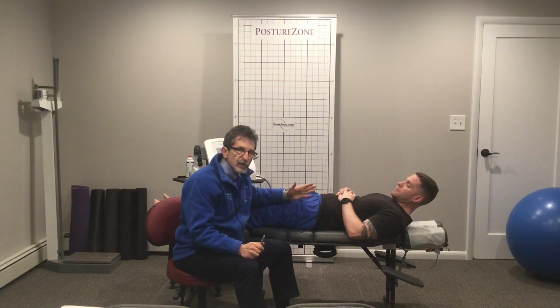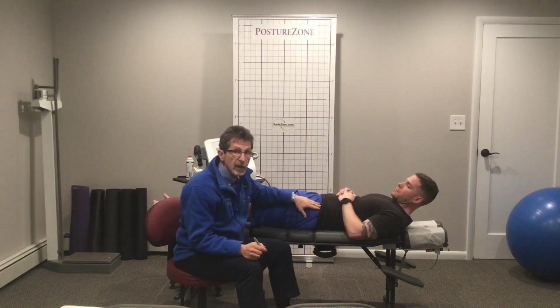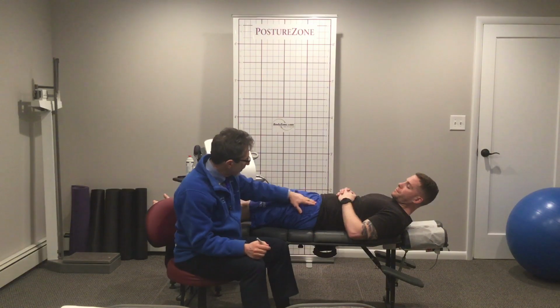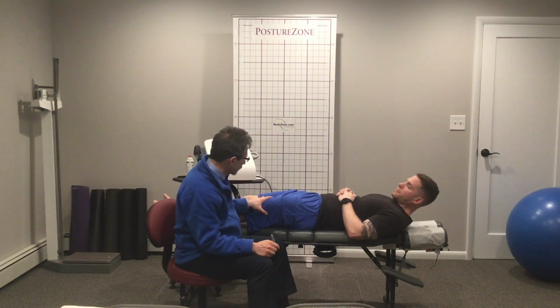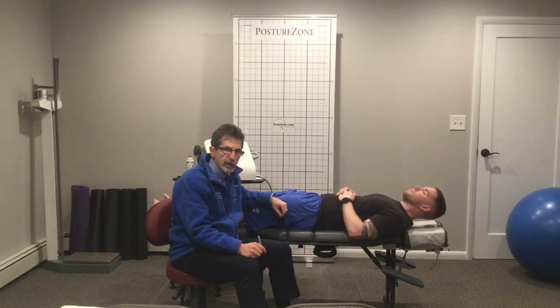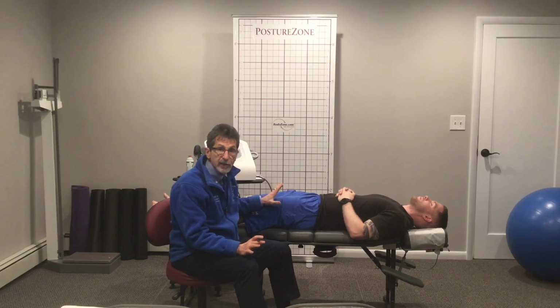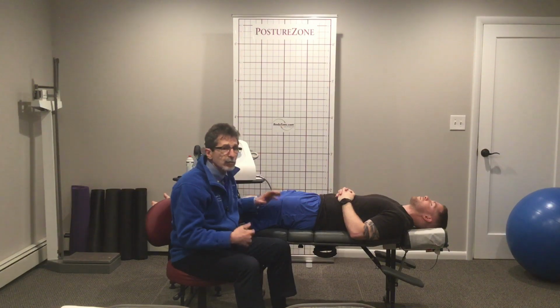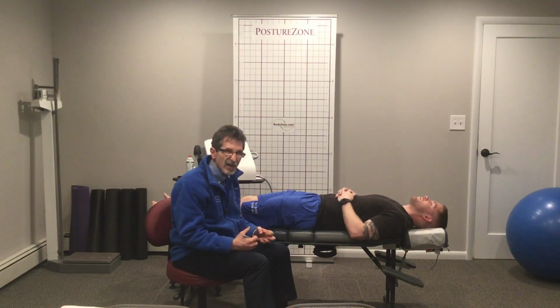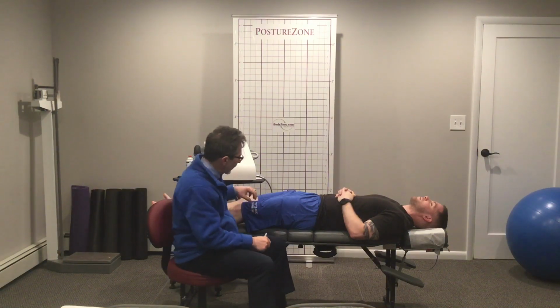So our job first is to differentially diagnose what muscle's involved. And sometimes even a sports hernia can mimic a hip flexor strain. In this case, we've analyzed it, we've determined that it's the rectus femoris that's the problem. So how are we going to treat it? Well, it depends on, is it an acute strain and we just want to ice and rest it, and sometimes that's a really good thing to do, or is it more of a chronic situation where it's tight and stiff? Let's talk about how we can treat both of those with radial pulsed wave therapy.